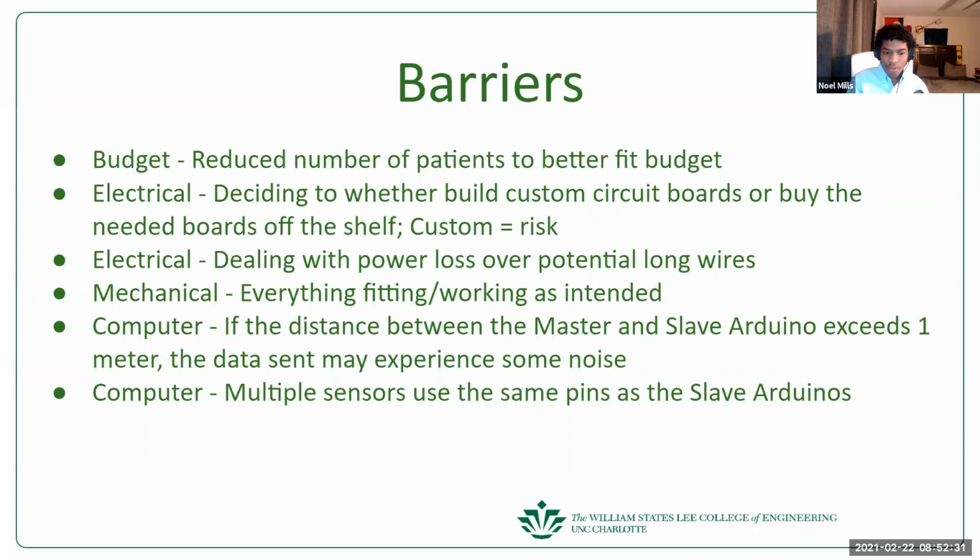So, within 1 meter, the Arduino experiences a lot less noise and is able to differentiate that this is from this component. Once you exceed 1 meter, it could be as simple as someone's phone easily messing with some of the communication, or a magnet. Yeah.